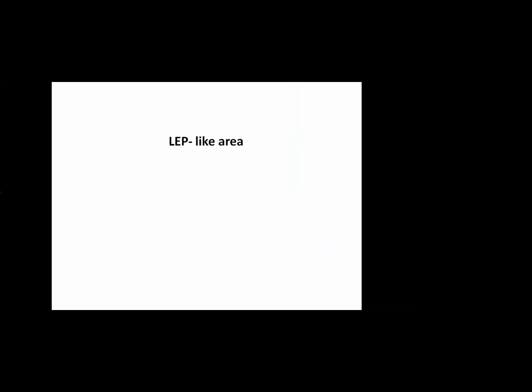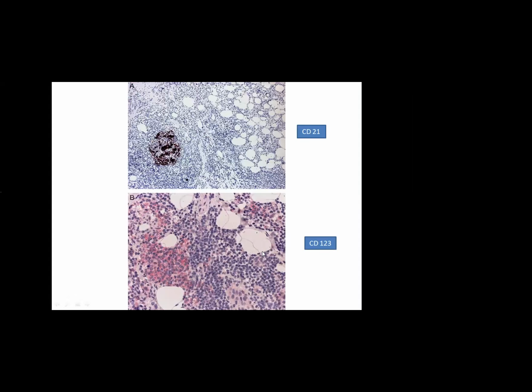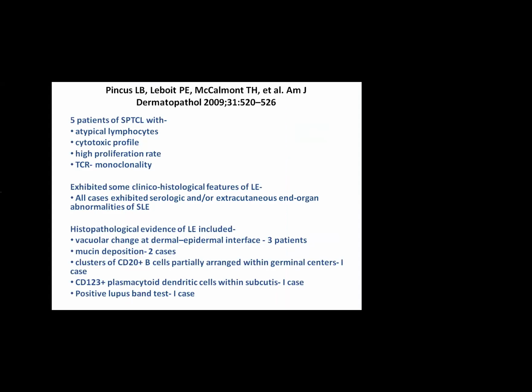They have a high proliferative index suggestive of a subcutaneous panniculitic T cell lymphoma, while there was a separate lupus panniculitis area which showed very dense lymphoid follicles, which is a characteristic feature of lupus erythematosus. And there was an increased infiltrate of plasmacytoid dendritic cells that are normally CD123 positive and are often seen in lupus erythematosus. So interestingly, within the same biopsy, both these foci are seen.